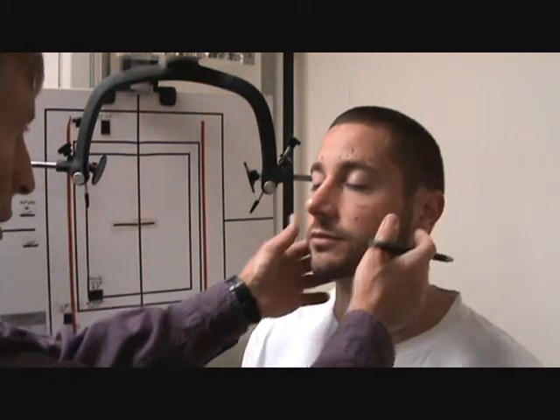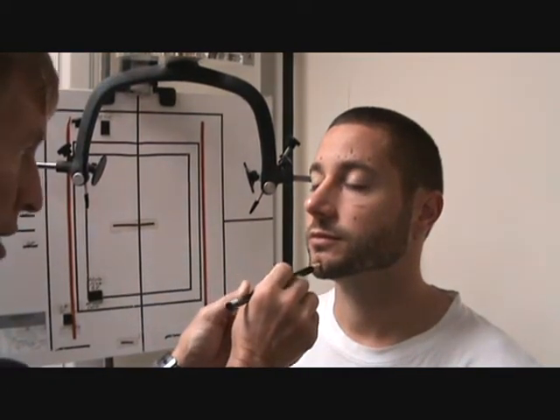When we take a right protracto view, the patient turns to the right, so the beam goes through the left maxillary sinus, through the opposite transverse process, and hits the bucky in the center. As the ear pointers are lined up on both sides to the posterior wall of the auditory meatus, we would have marked this patient for normal head carriage — it'd have a dot here and a dot here, all lined up.